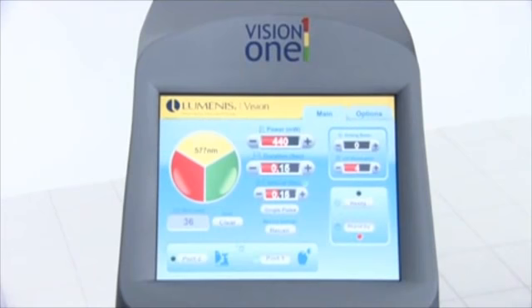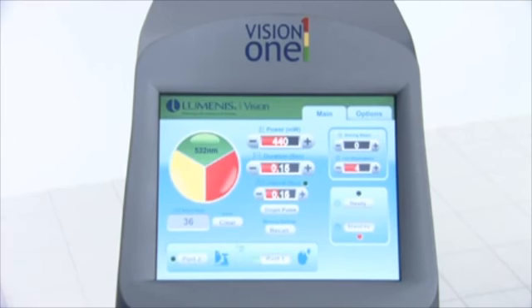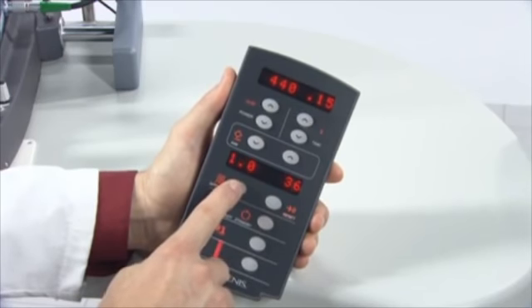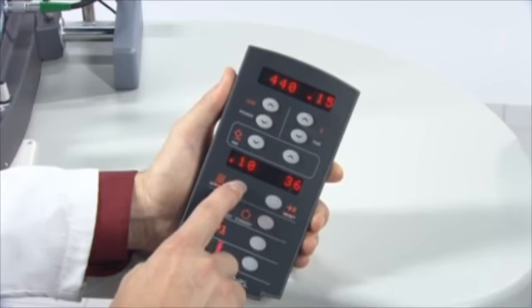To select single exposure mode, press the single pulse button in the show icon or interval field until SPL displays. To select repeat exposure mode, press the single pulse button in the interval field until the interval setting displays. Then press the plus (increase) and minus (decrease) selectors to select the desired treatment interval. To select single exposure mode from the remote control, press the show icon selector until the SPL displays. To select repeat exposure mode, press the show icon selector until the desired treatment interval setting displays.